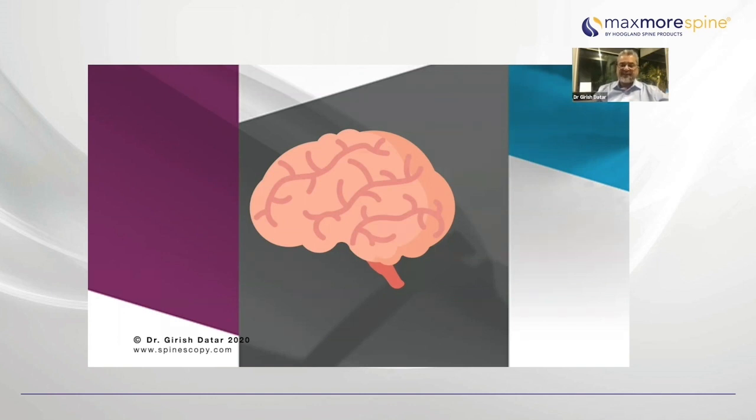In cases where there is a concomitant foraminal and extraforaminal stenosis, because the compression could be bone, could be soft tissue, then the choice of procedure again is going to be not only that you decompress the lateral recess, but you also decompress the foramen and the extraforaminal part.